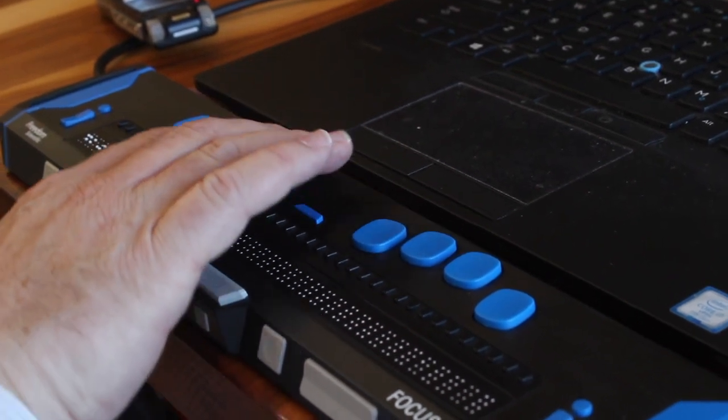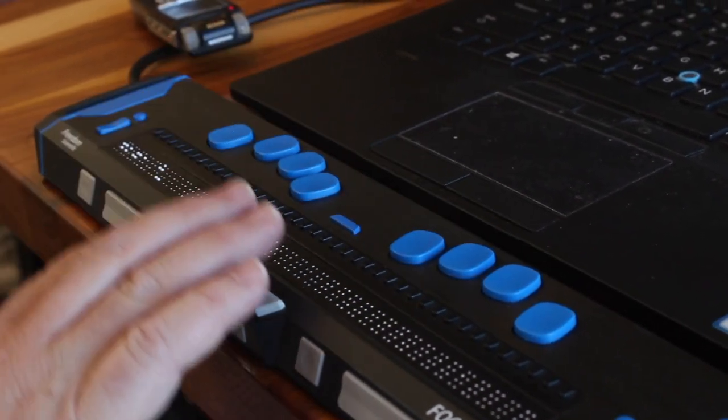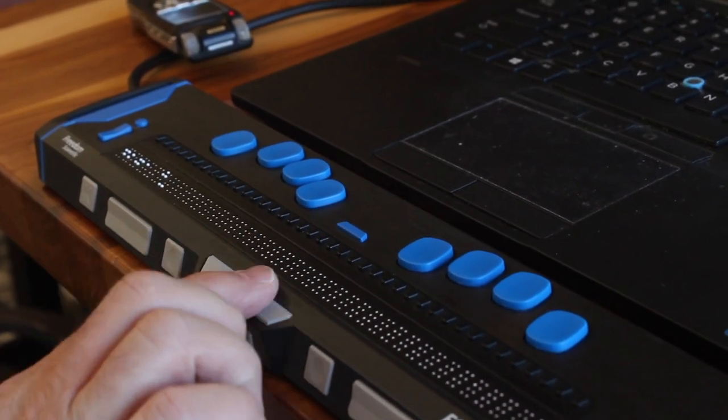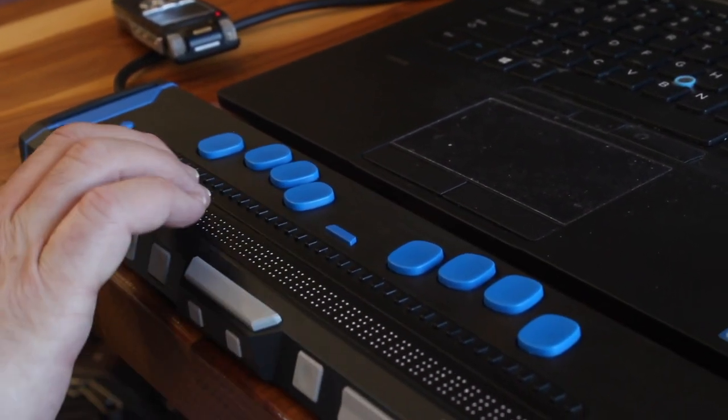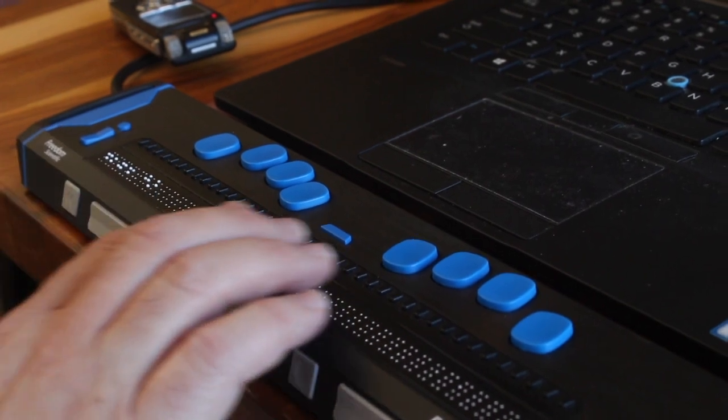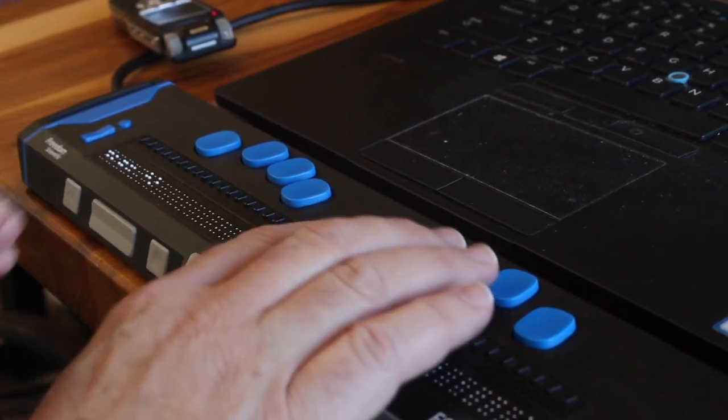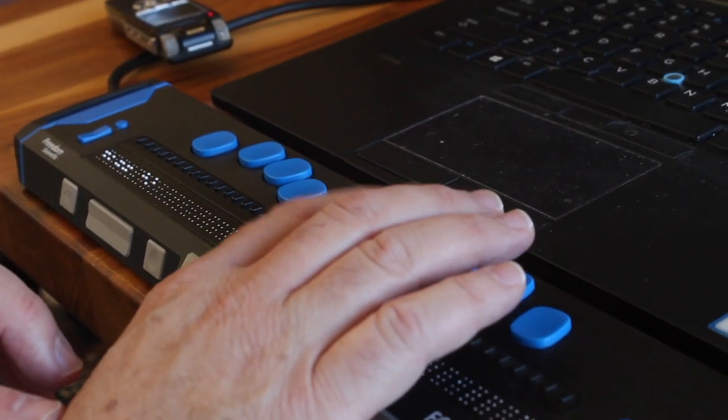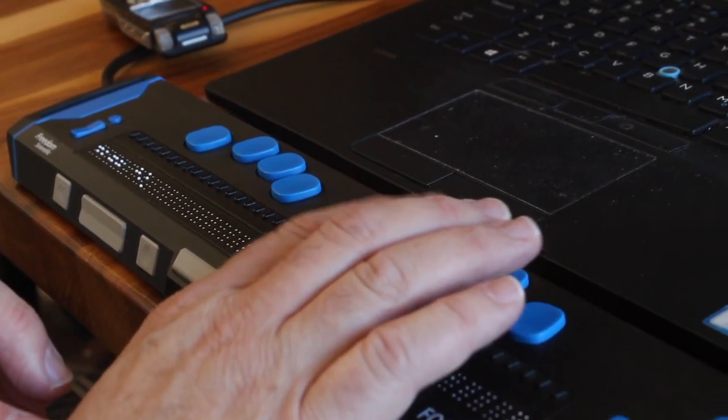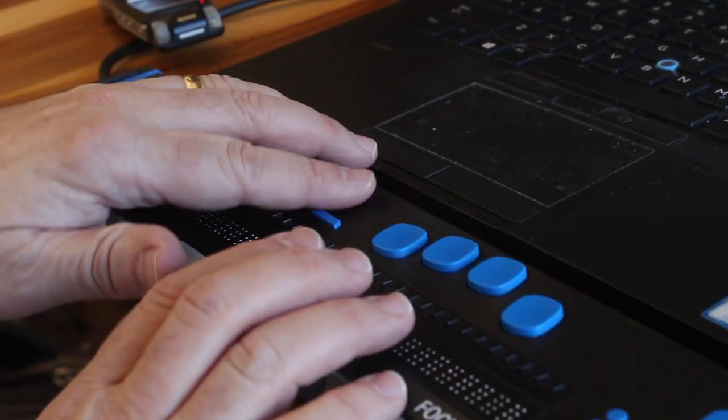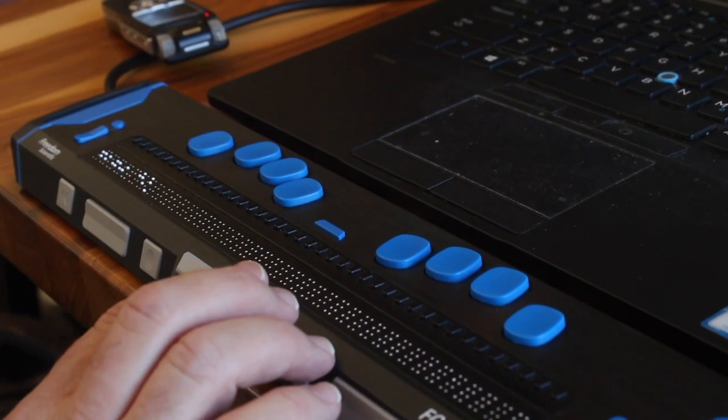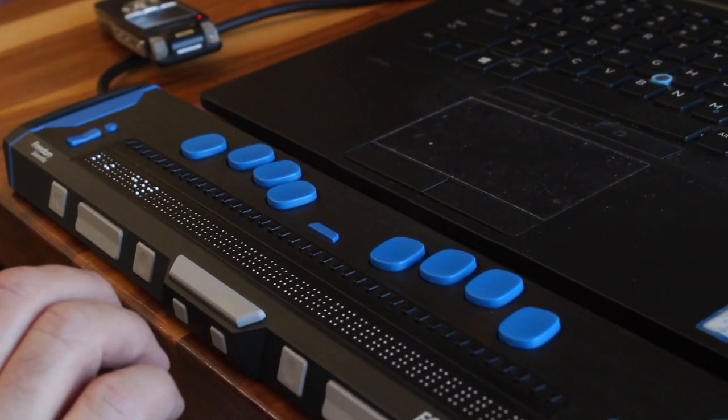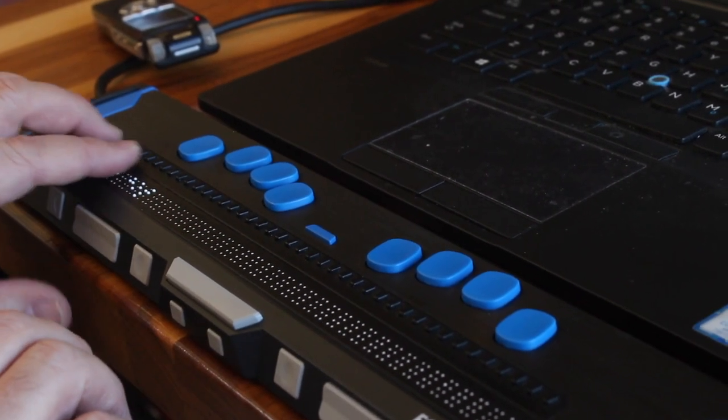But I could press the letter O by entering dot 5, dot 1, and dot 3, followed by the space. And finally, the letter T, dots 4, 5, 3, 2, space. There's the word hot.